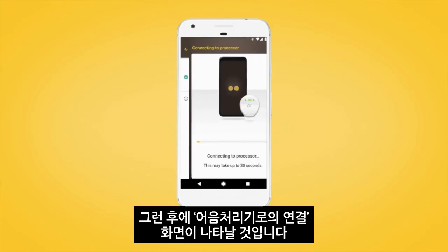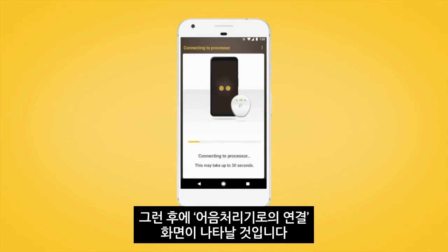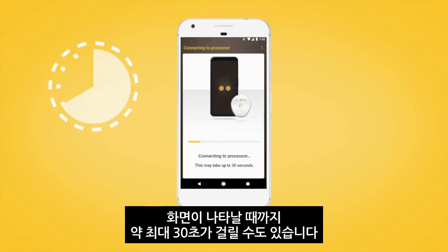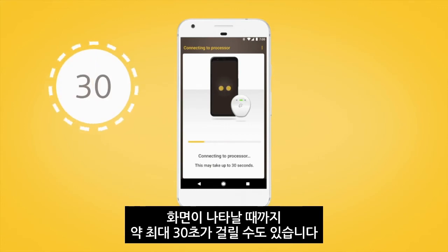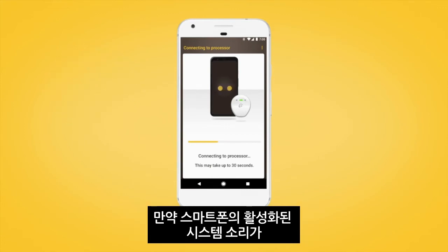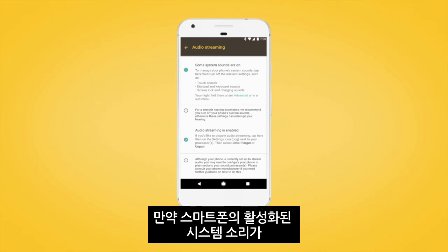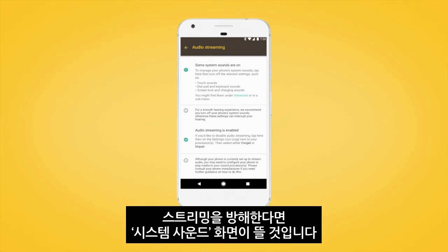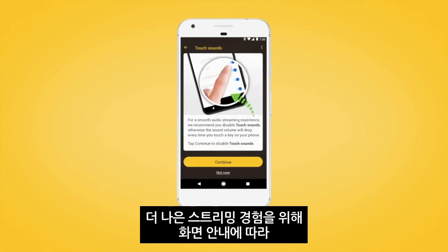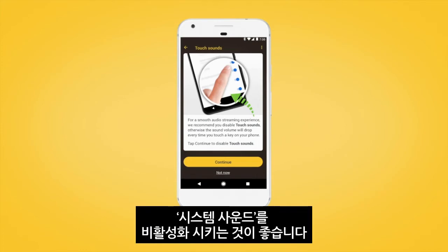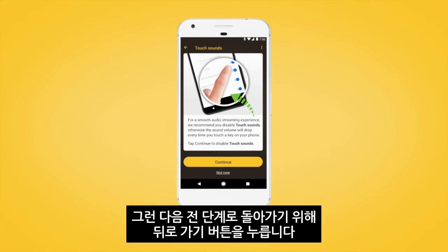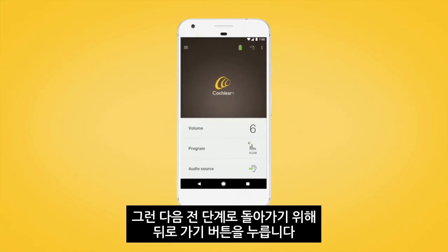The 'Connecting to Processor' screen will then display — it may take up to 30 seconds for it to appear. If you have any system sounds enabled on your smartphone that will interfere with streaming, the system sound screen will display. For a better streaming experience, we recommend you follow the screen prompts to disable system sounds. Then tap the back button to return to the Nucleus Smart App.